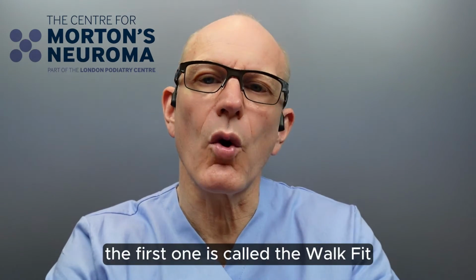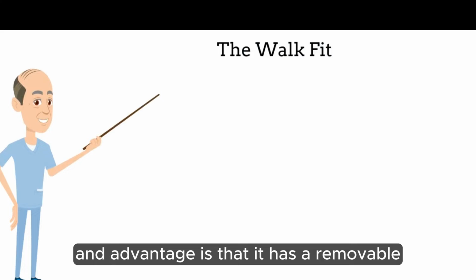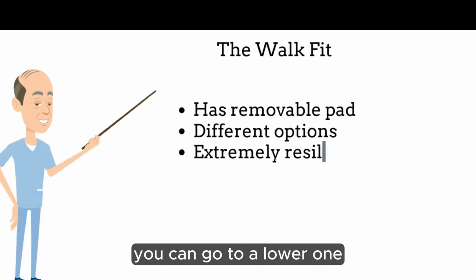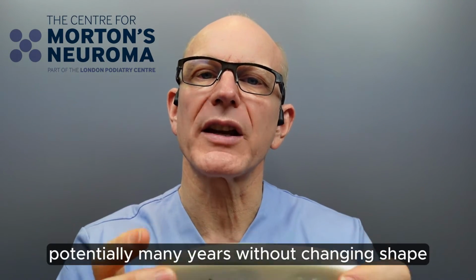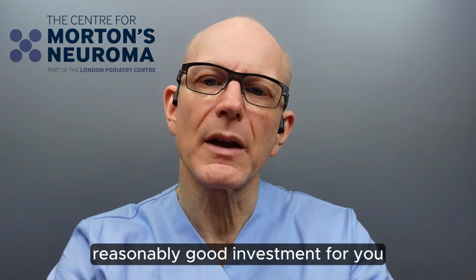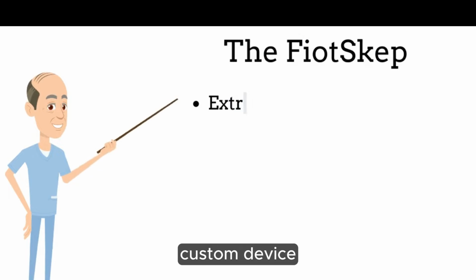The first one is called the WalkFit. So this is a WalkFit orthotic. And the advantage is that it has a removable metatarsal pad that you can place into the device, and then it has a couple of different options so that if one is too prominent, you can go to a lower one. And the advantage of this is that it's extremely resilient, extremely tough, and will last potentially many years without changing shape. So if you do find something like this helpful, it's going to actually be a reasonably good investment for you. We tend to stay away from the EVA foam type devices. If people need that, they're much better off just investing in a custom device, as already stated.